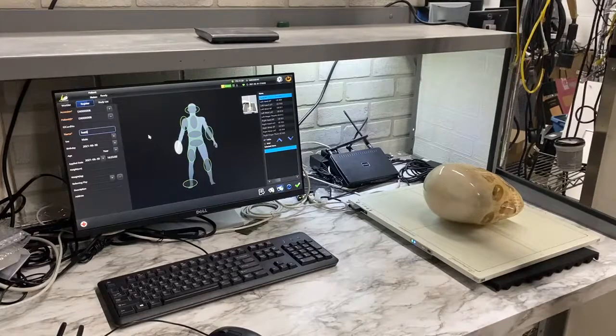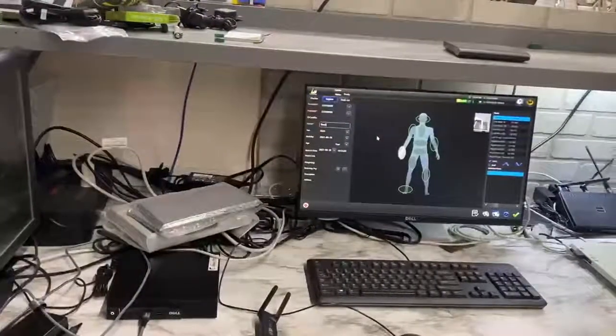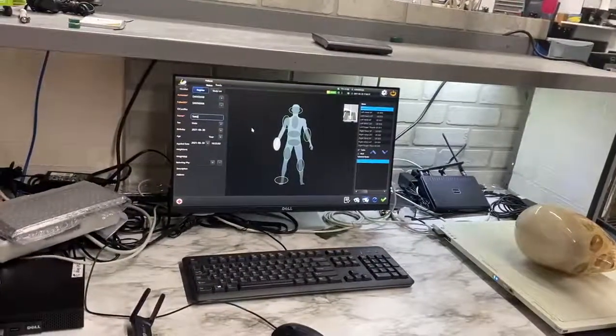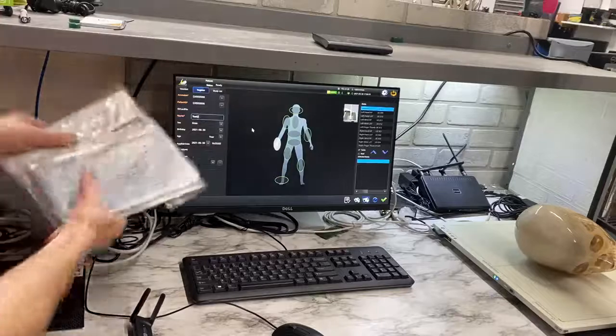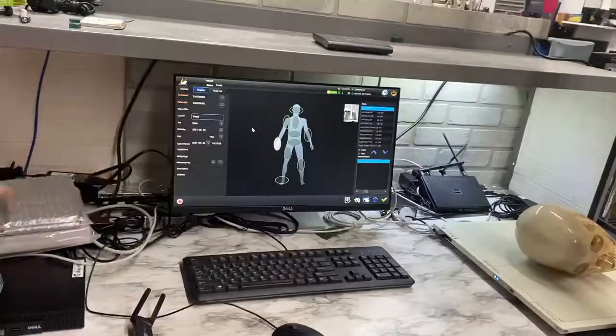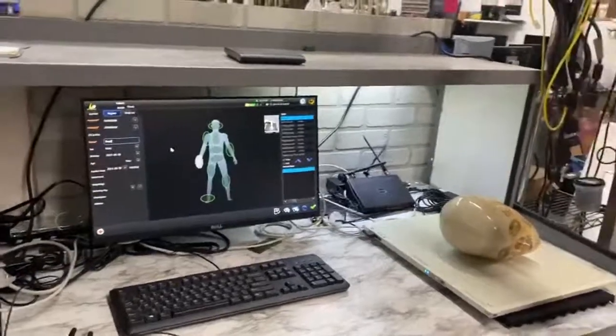It comes with everything you need to do that, which is basically the panel itself, the computer workstation over here, the monitor, and a battery charger — it comes with two batteries. You can use it in the wireless battery mode or you can power up the DR wired. If you're not going to be moving it away from the bucky, you can just power it with the tethered cable.